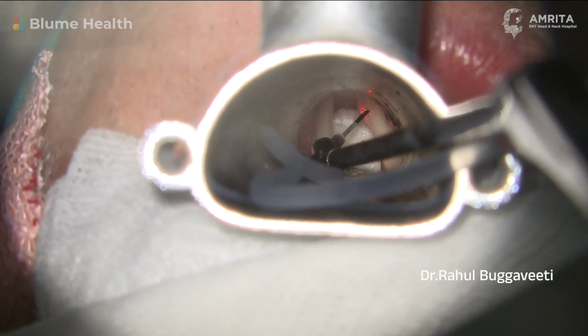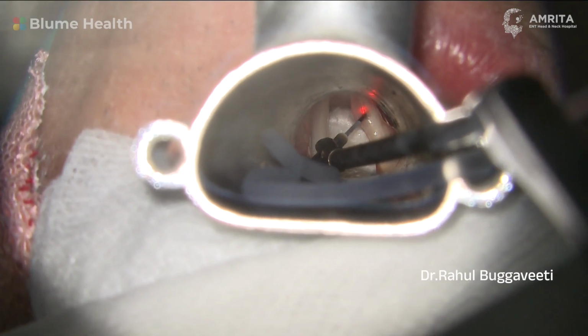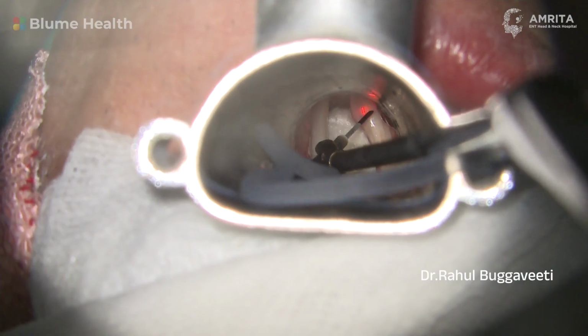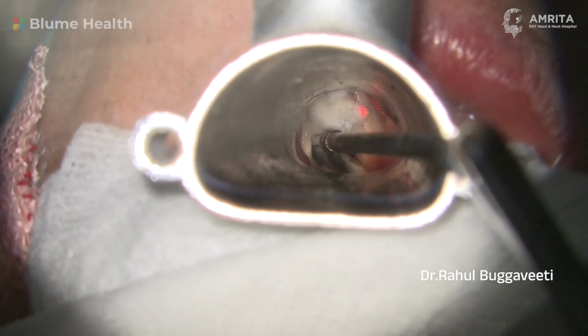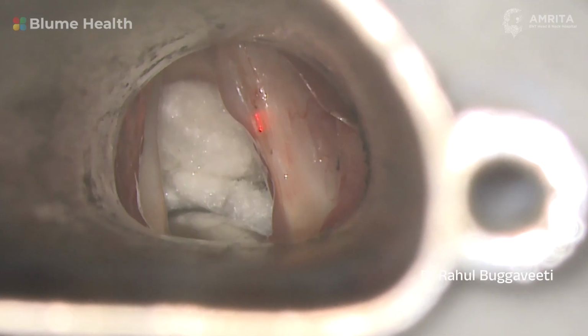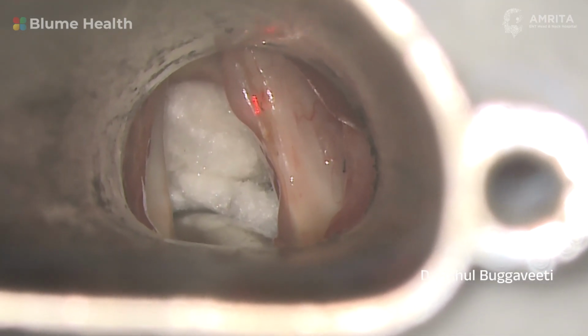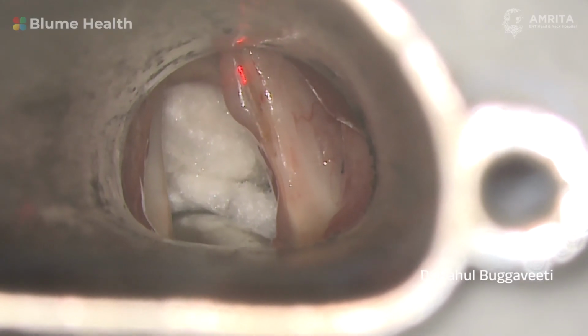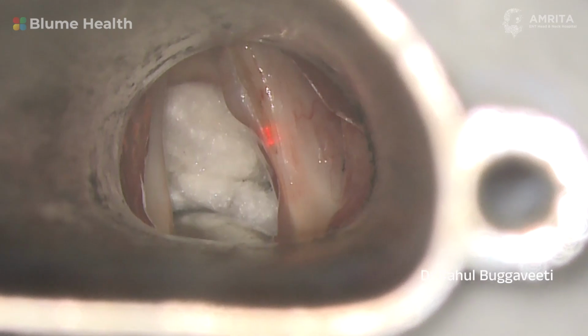This is a case of right vocal cord cyst planned for laser microlaryngeal surgery. Here, infiltration is given into the right vocal fold with saline. Saline causes separation of the cyst from the vocal ligament, and saline inside the vocal fold will absorb the energy from the laser and prevents injury to the vocal ligament.